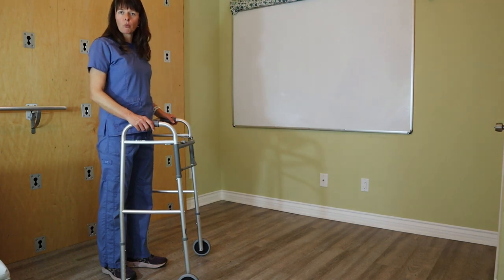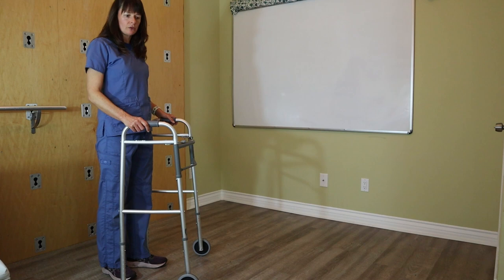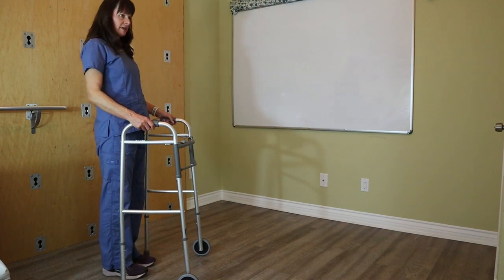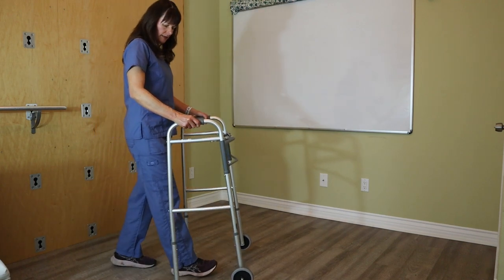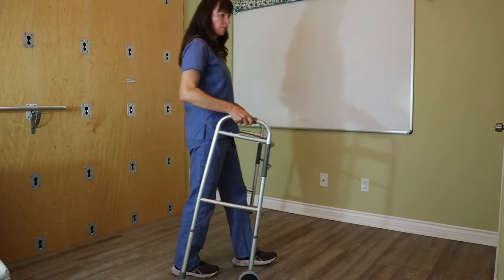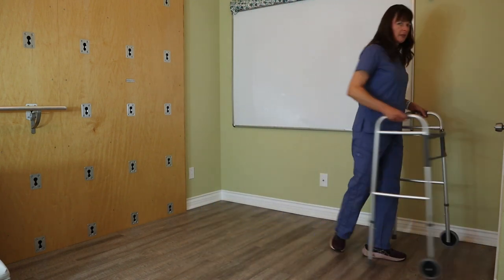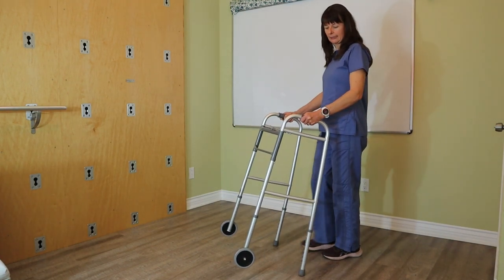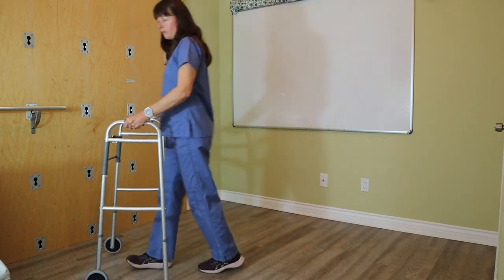Now if this was a walker with four legs rather than two legs and two wheels, we would teach the patient the same thing. The sizing is the same, except they're going to put the walker down back legs first, then the front legs, then pick it up and move it forward as they move themselves in. What I'm doing here is extending the arms just slightly, then moving in, then moving the walker forward again.